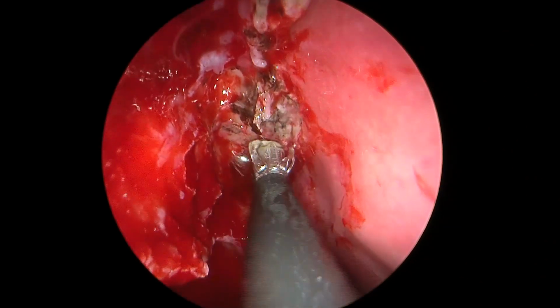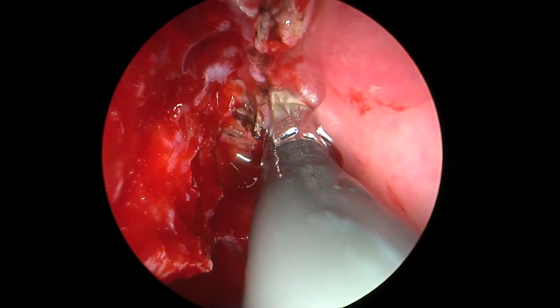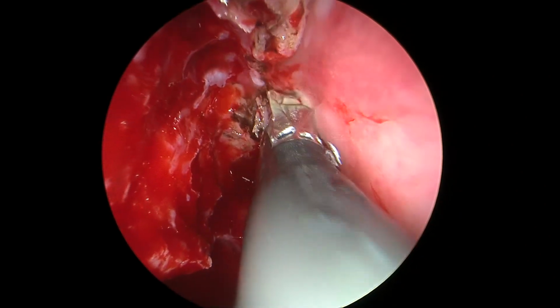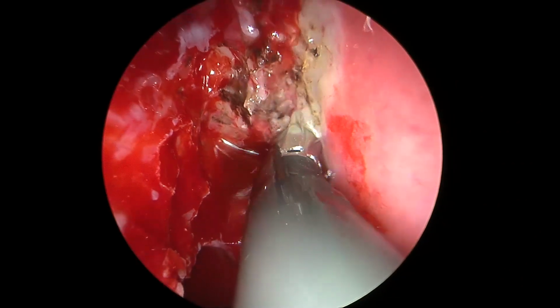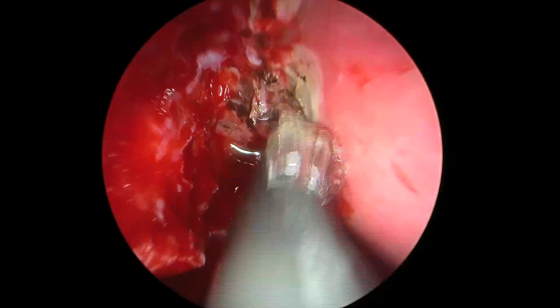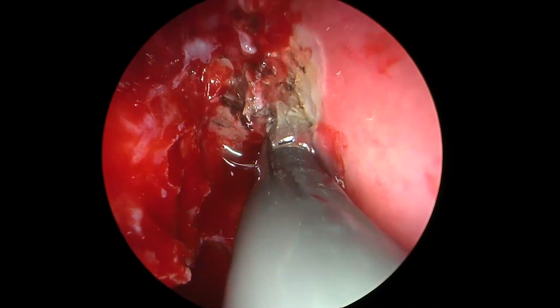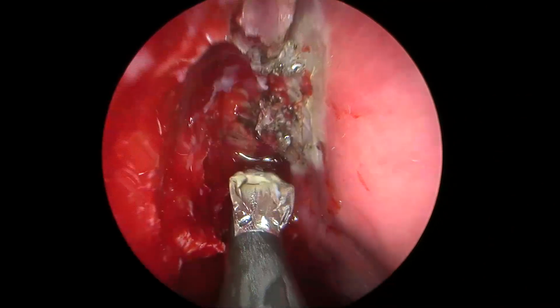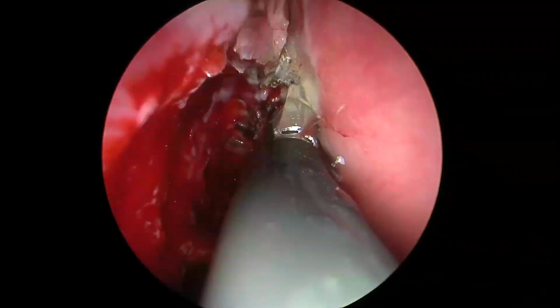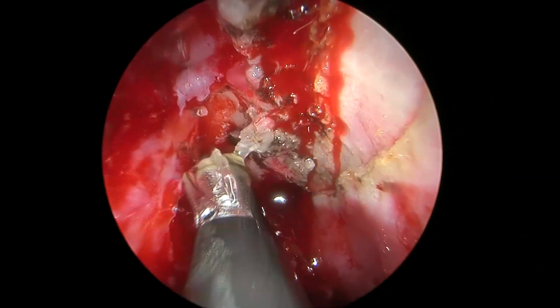So we always believe in exposing and denuding a large surface area for our grafts to well set. Grafts will never settle down or adhere to mucosa. One needs to give the graft, whatever that be, bare bone, and I repeat, flat bone as much as possible. So whatever septations one can remove, one must remove either through cutting instruments or through drills. You can see the axilla here, the erstwhile attachment of the middle turbinate area.